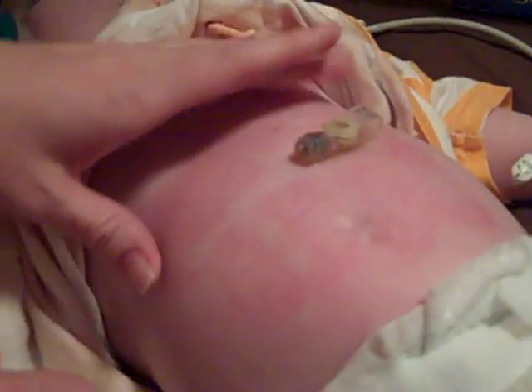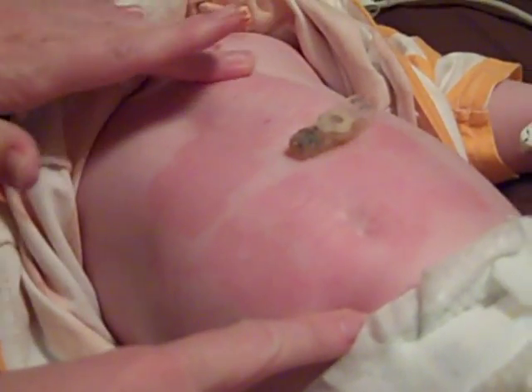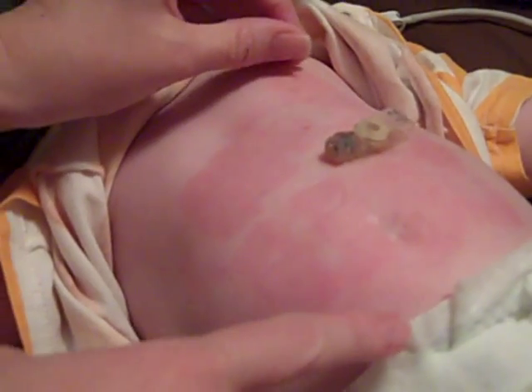Now, if I wasn't giving Benjamin a bath, I would go ahead and wipe off where I put the adhesive, because as you can see, it's starting to go red. But I will go ahead and put him in the bathtub, and that way I don't need to wipe it off.